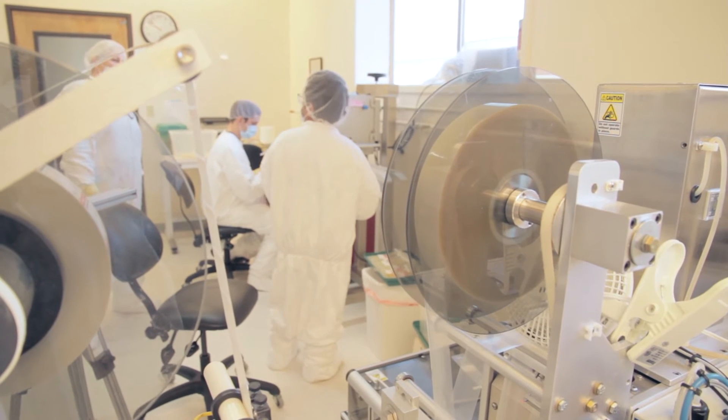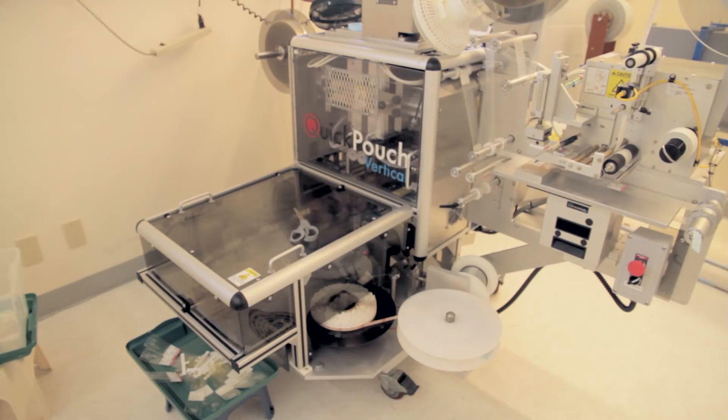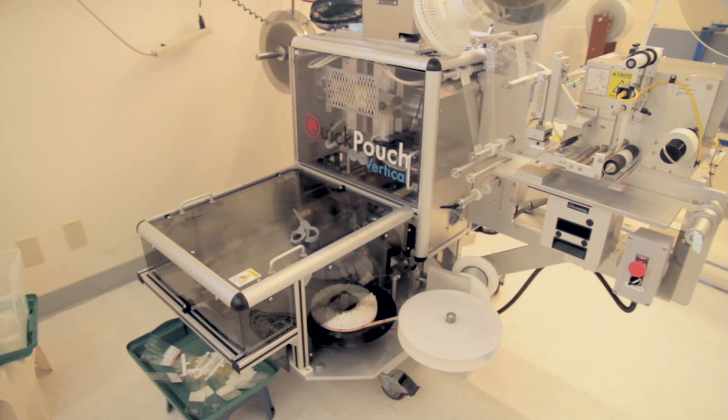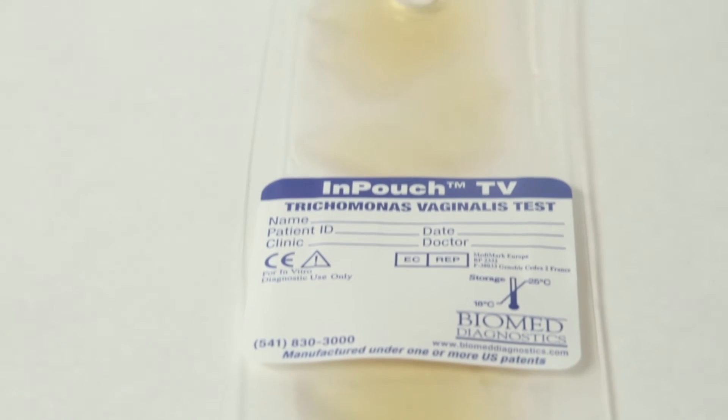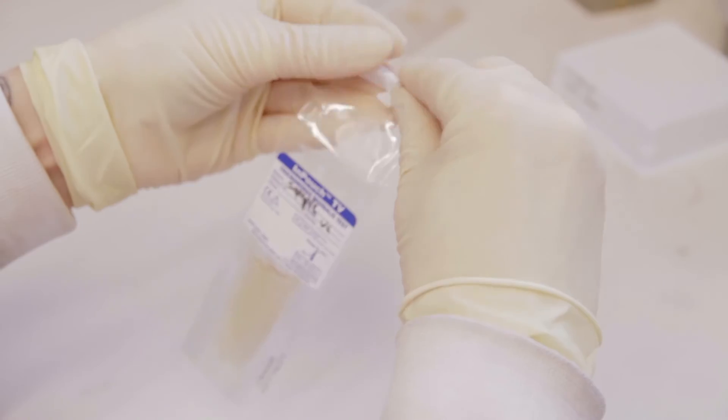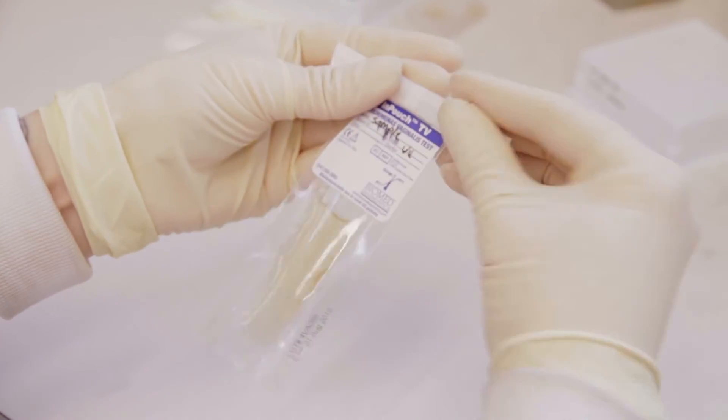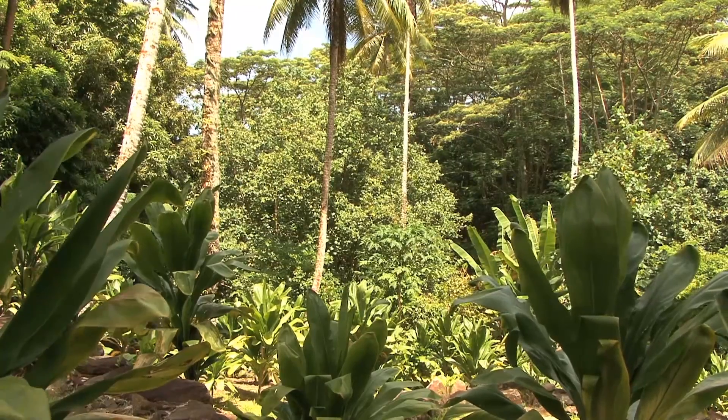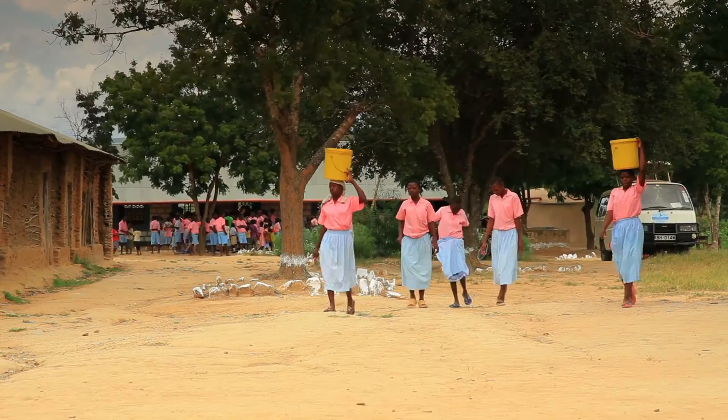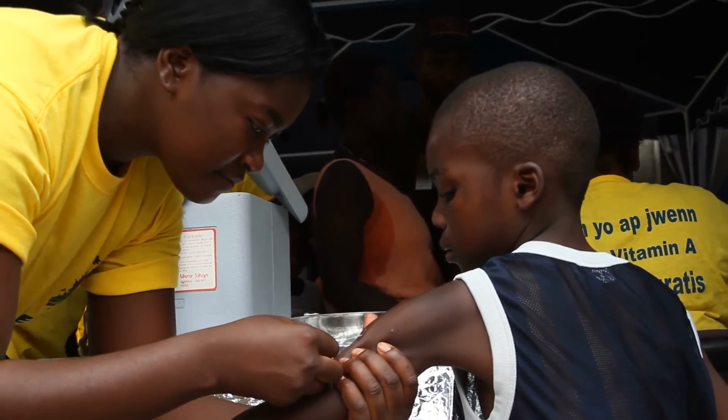Following Biomed's purpose design mission, the InPouch TV Diagnostic device is made of high-quality clear plastic which fosters the growth and eases the observation of T. Vaginalis. This durable, self-contained device is perfect for challenging environments and regions where purpose-built simplicity and functionality are mandatory characteristics.